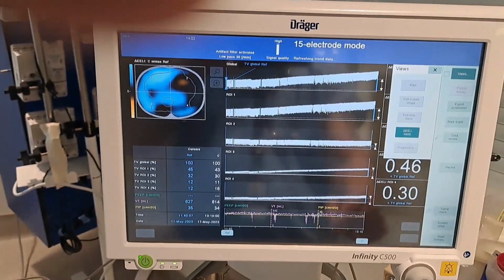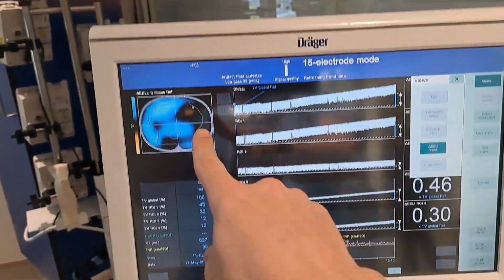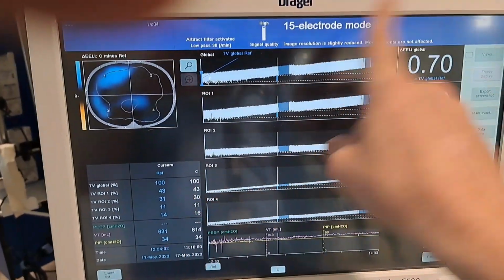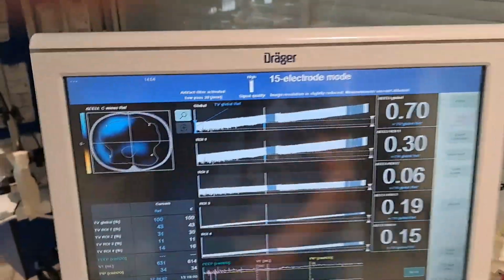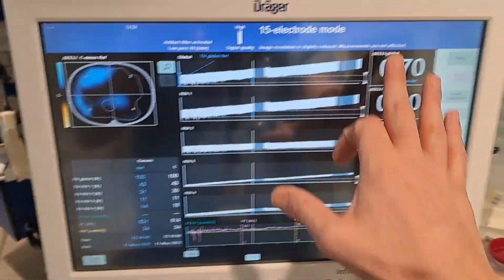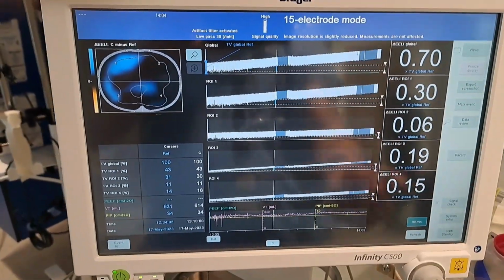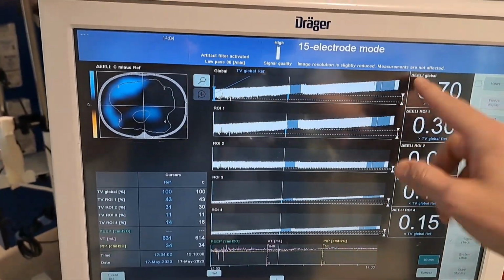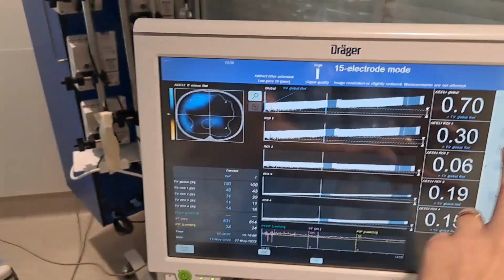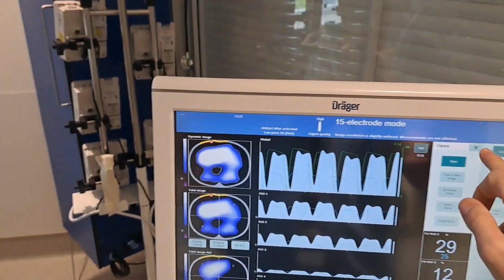This is typically, when you see these things going up, it's telling me, oh yeah, there's recruitment, great. But that's not true. You cannot trust these impedance values and any of the trending here while fluid is being removed. So this is just fluid. So be careful with dialysis. Not everybody knows that, but you can trust, obviously, the images and the percentages.